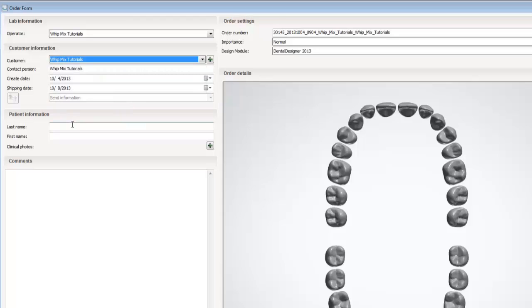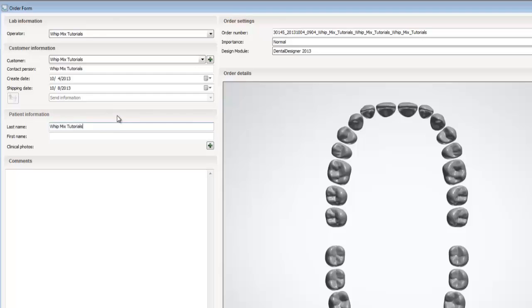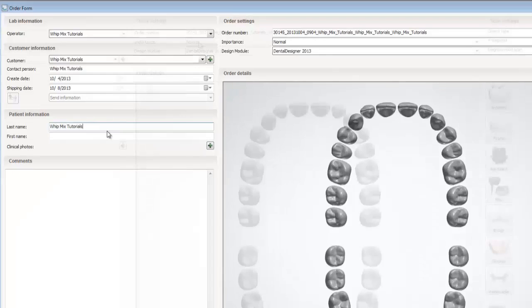Now that we have our customer selected, we can input more information. I submit all the cases information into the last name. The reason being that whatever information you put into the first name by default won't be displayed in the dental manager.